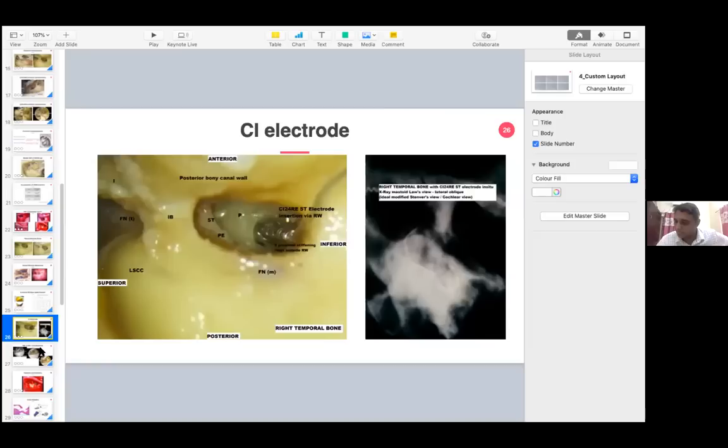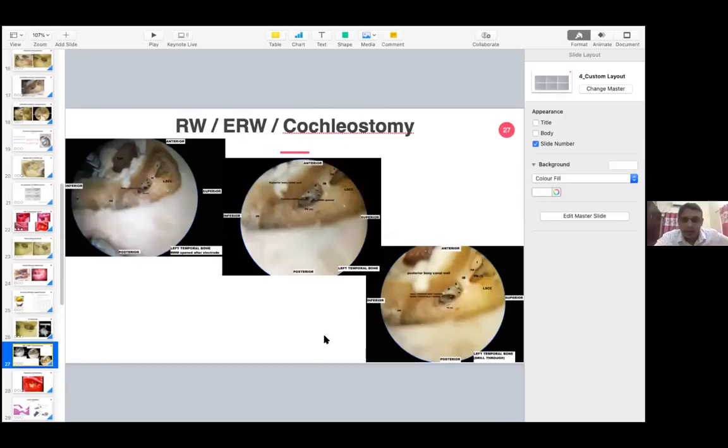There are a couple of questions on cochleostomy site. What is the site of cochleostomy? Anterior, inferior, posterior? Where is the crista fenestra? And how do you do the extended cochleostomy? Okay, great. So there are three questions, right? The site of cochleostomy, how do you drill the crista fenestra, and the types of cochleostomy.